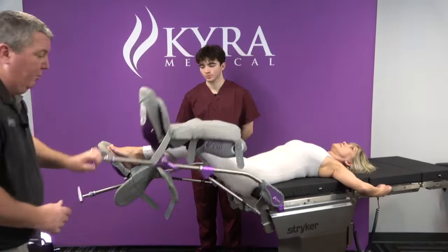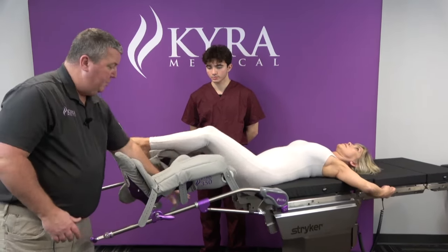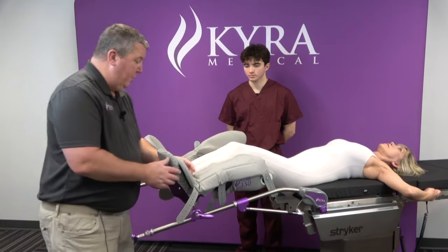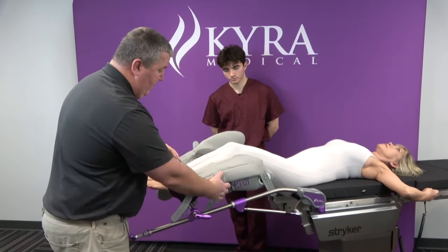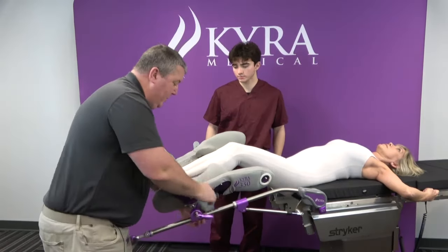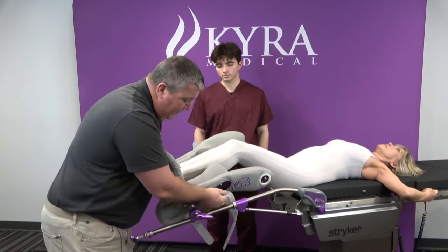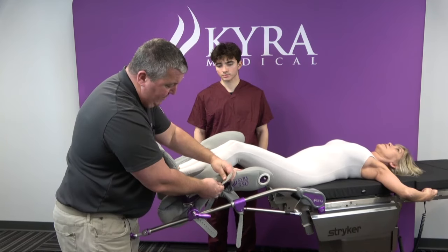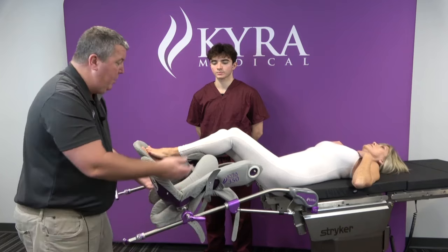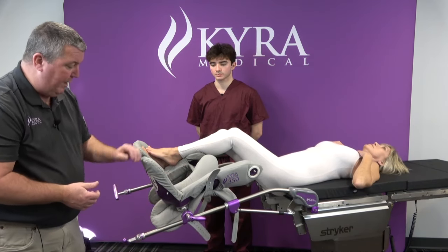I'll bring this down to level. At this point, the patient would be on a leg transfer board or on a table extension. I'm going to open up the stirrup. Because our stirrups are moving medial to lateral, I'll take that middle strap and connect it. Then put the top pad underneath the stirrup boot so that we have room to manipulate the patient's leg without the top pad being in the way.